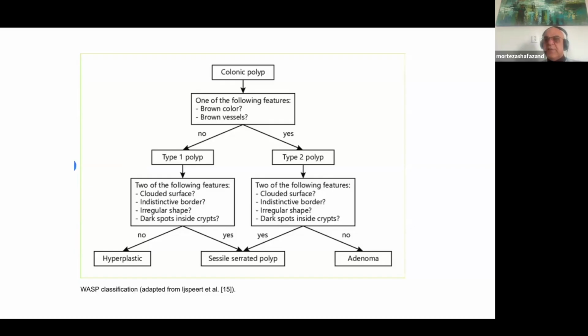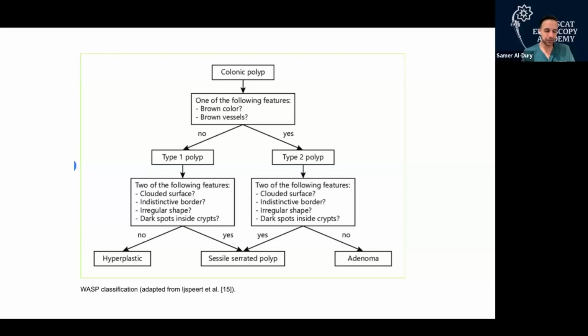If I have a newer instrument, my processor machine is the X1, Olympus, and you can use the TXI mode. It helps with the texture of the lesion and the mucosa. Then you see something that is not normal, and it gets your attention a little more with the TXI. That's why all of my colonoscopies nowadays I do with the TXI mode on, always. In colonoscopy, not gastroscopy.